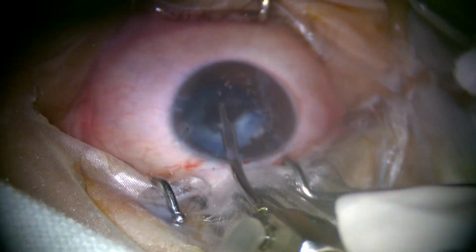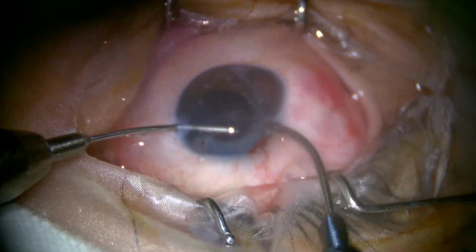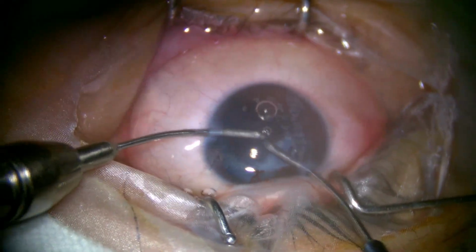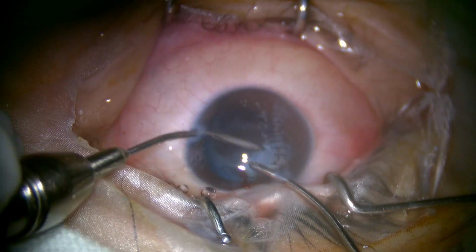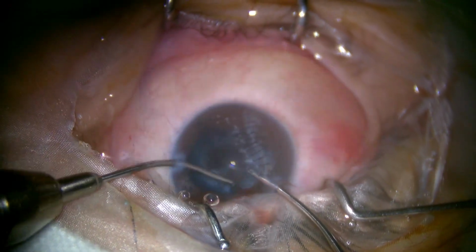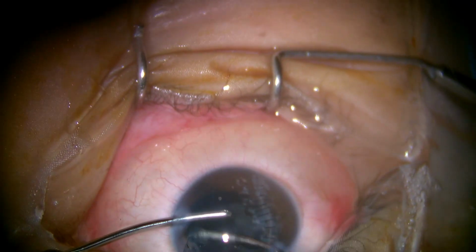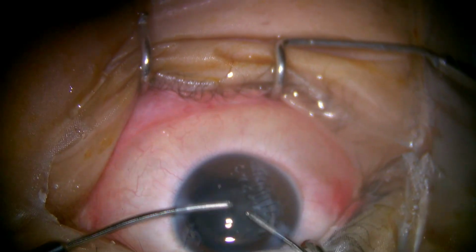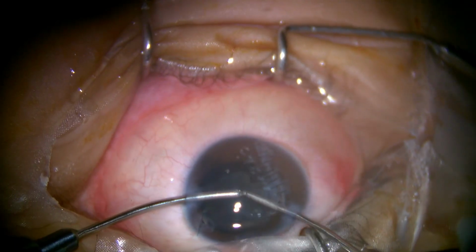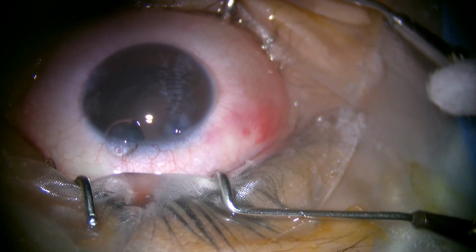Once we were sure of the posterior capsular integrity, we performed the lens aspiration by bimanual irrigation and aspiration cannula. Anterior chamber is formed.